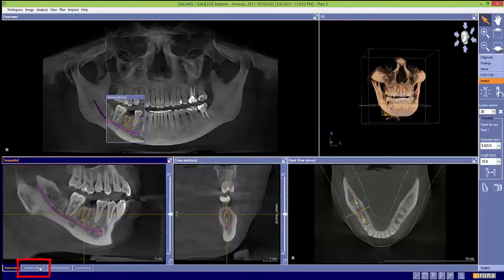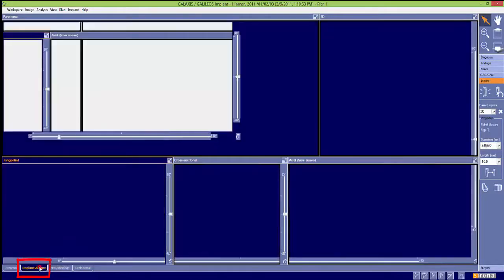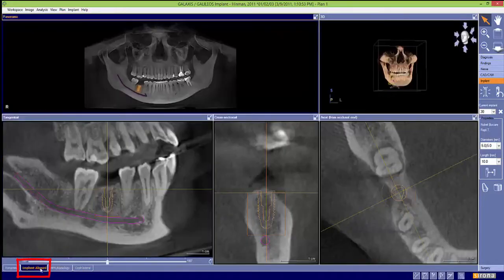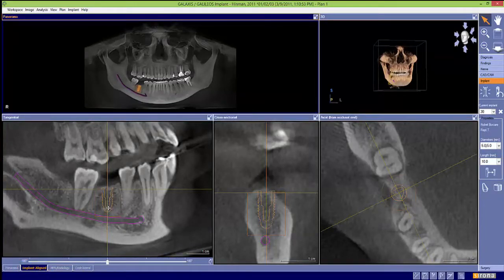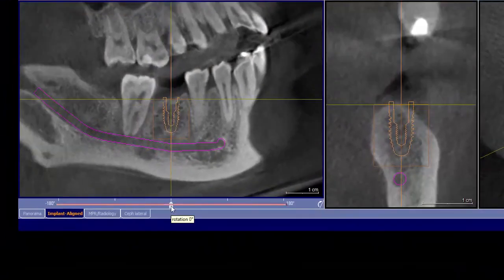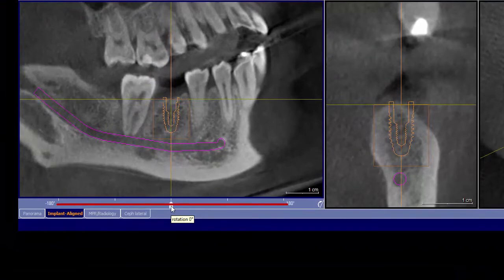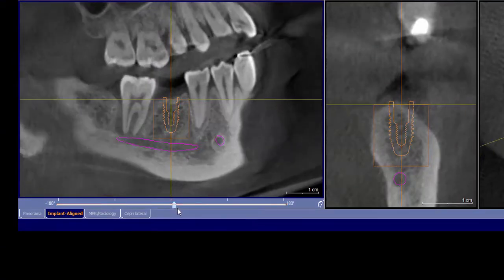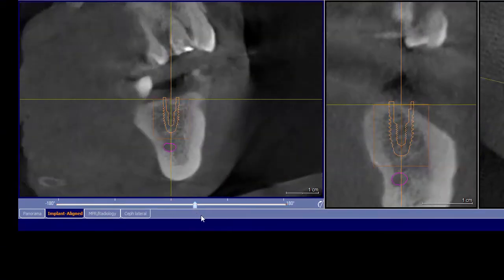Now select the implant align tab on the bottom left. This window will show you the details. If you want to move the implant bodily, left-click and drag. The slider bar allows you to rotate 360 degrees around the axis of the implant.